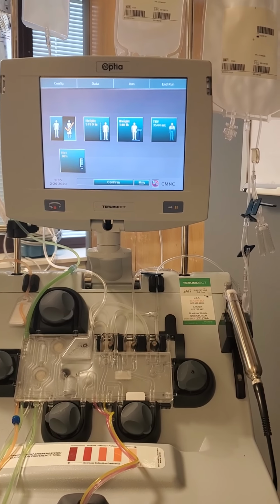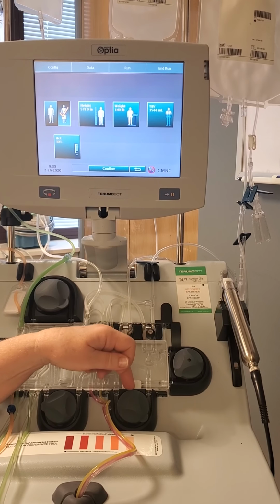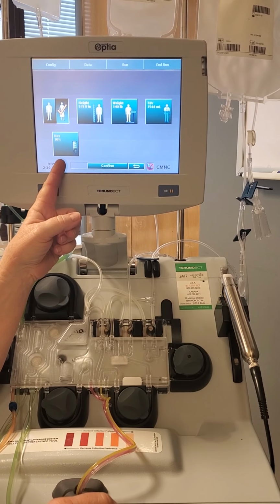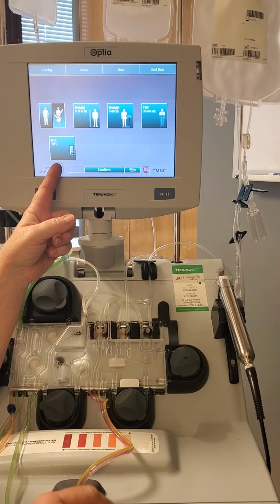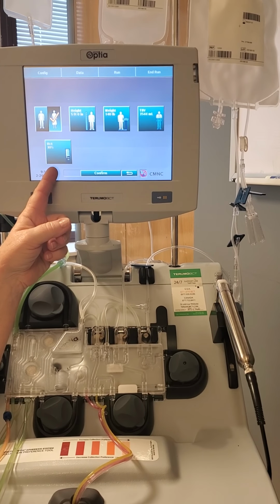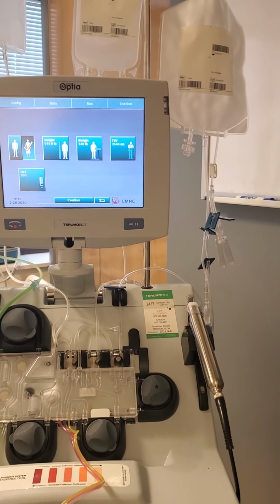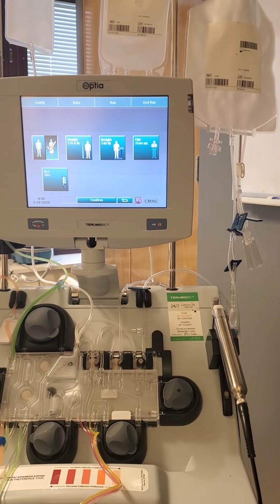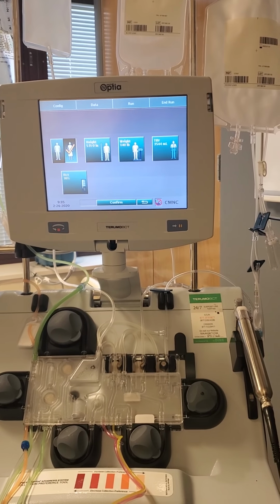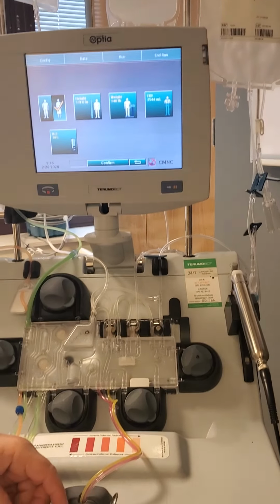And so what will happen is that AIM will make as many adjustments to the plasma pump flow rate as she can based on this piece of data, and the interface still will not be ideal. And what's the ideal interface position? 50-50. That means the connector is half filled with plasma and half filled with what else? Red blood cells. Exactly. So this is what we're trying to obtain in that connector, the 50-50 interface position right here.